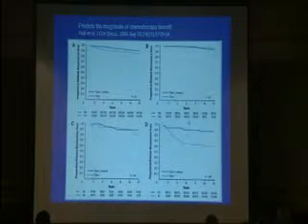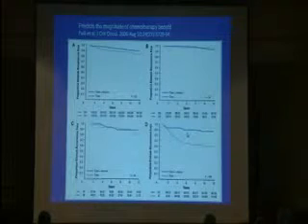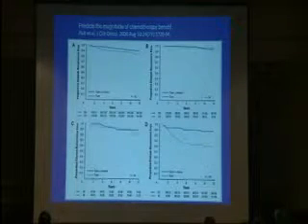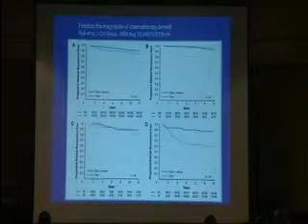The blue line represents patients with high-risk recurrence score that receive tamoxifen and chemotherapy. The red dotted line represents patients with high risk that only receive tamoxifen without chemotherapy. And you can clearly see that the patients who received chemotherapy had a much better survival. So the recurrence score can actually help predict whether patients are going to respond to chemotherapy or not.